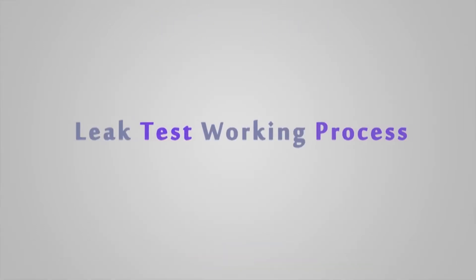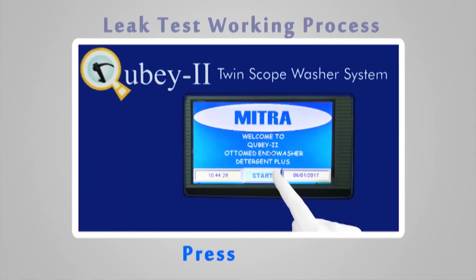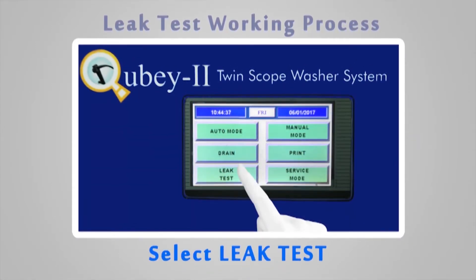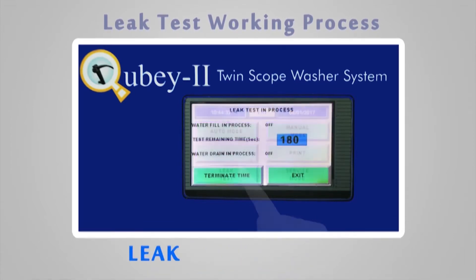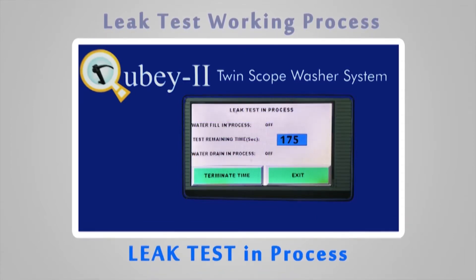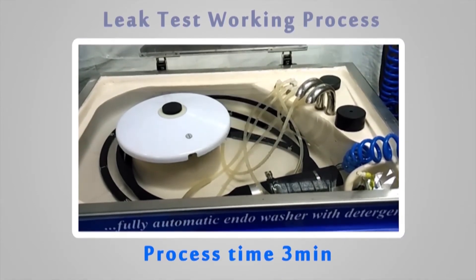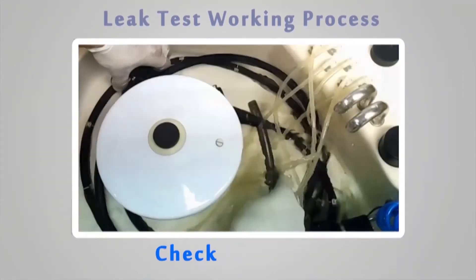Leak test working process: press Start, select Leak Test. Leak test is in process. Process time: 3 minutes. Check manually.